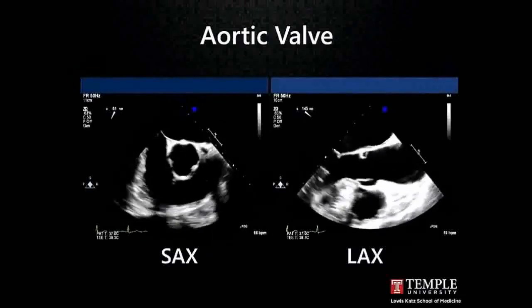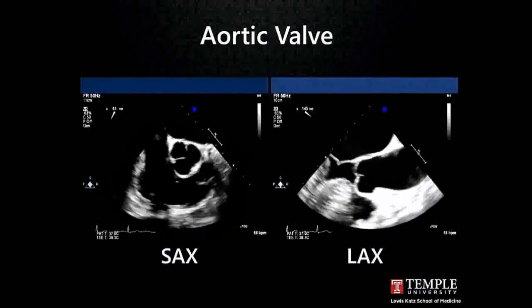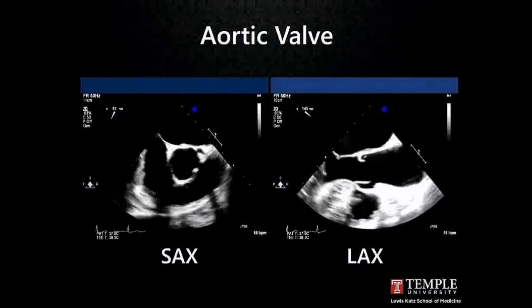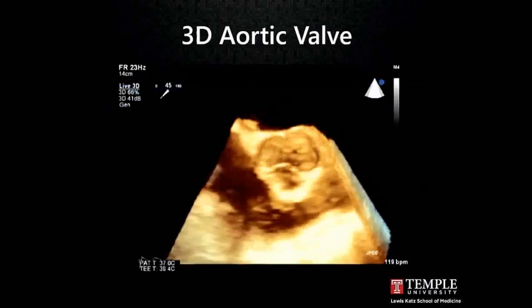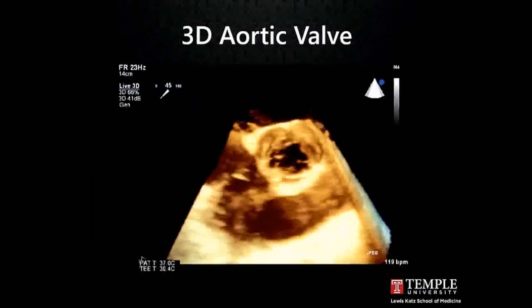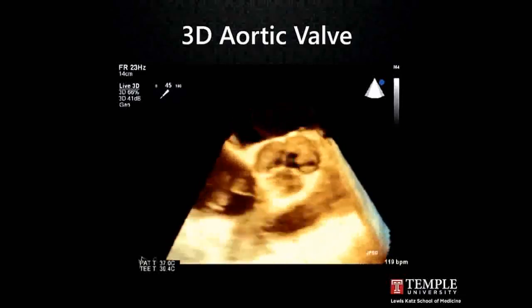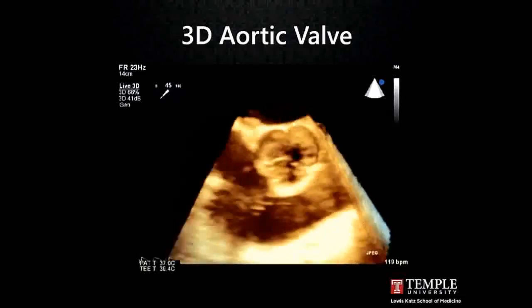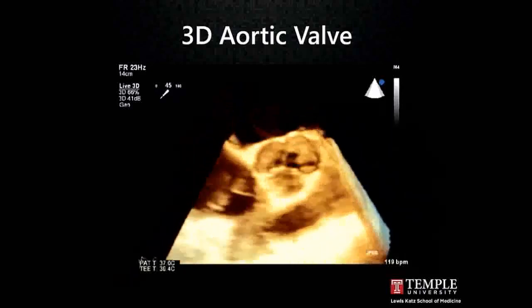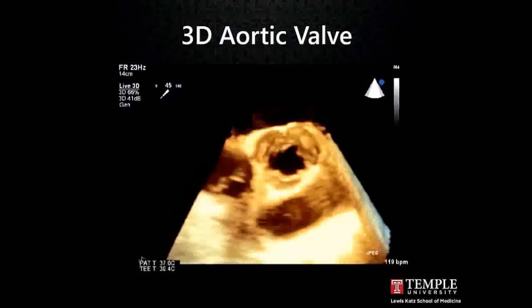Because of the multiplane nature of TE, you can look at a short axis and long axis with fairly few limitations in terms of acoustic artifact. I hope that projects appropriately, but you could be presented with a 3D image of the aortic valve as well, asking things like cusps and coronaries and pathologic findings as well, and asking what cusp they might be associated with.